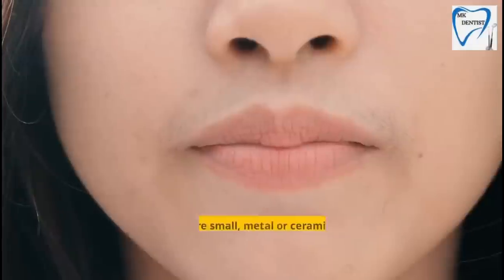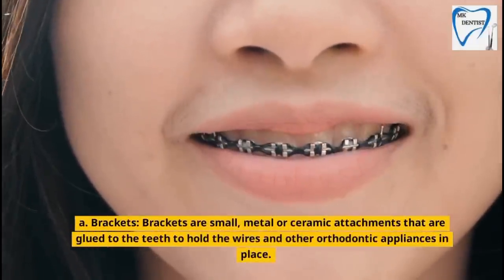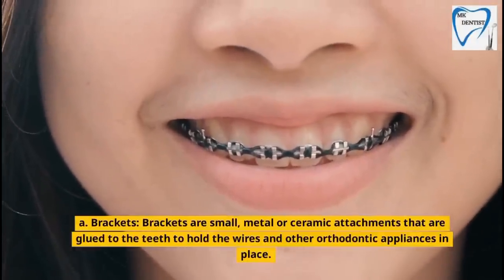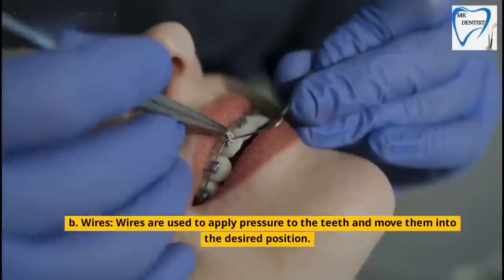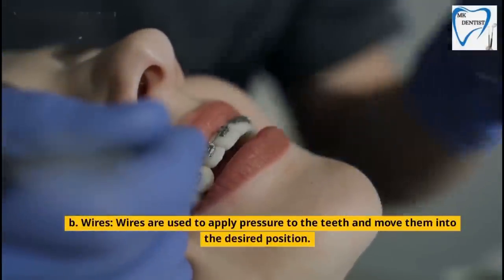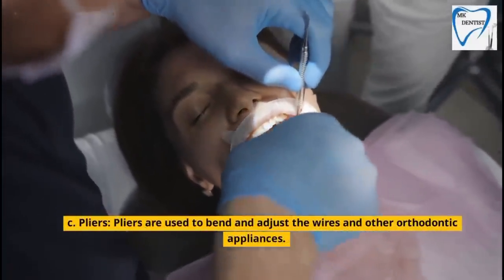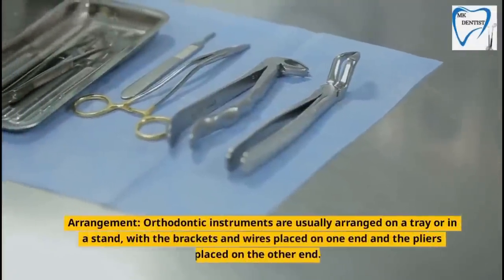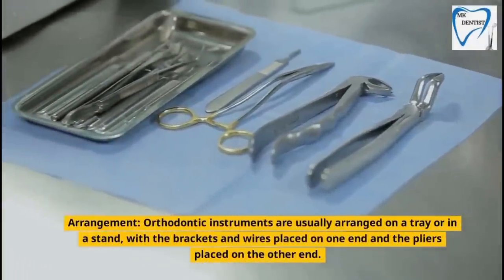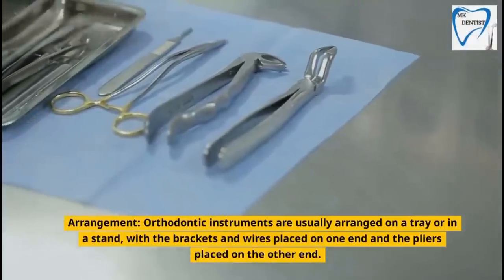Orthodontic Instruments. A. Brackets — Brackets are small, metal or ceramic attachments that are glued to the teeth to hold the wires and other orthodontic appliances in place. B. Wires — Wires are used to apply pressure to the teeth and move them into the desired position. C. Pliers — Pliers are used to bend and adjust the wires and other orthodontic appliances. Arrangement: Orthodontic instruments are usually arranged on a tray or in a stand, with the brackets and wires placed on one end and the pliers placed on the other end.